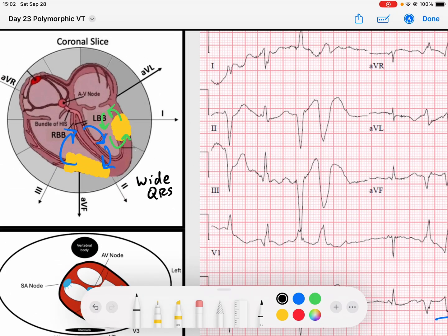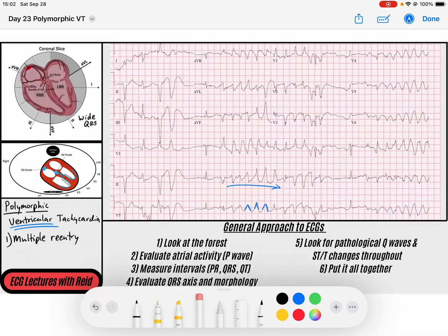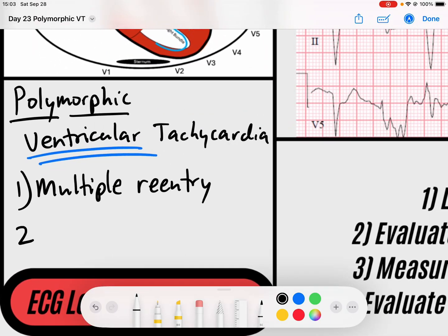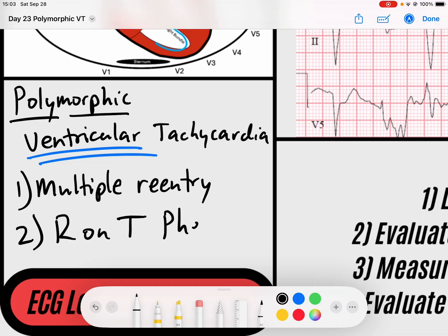The other way that we can get this is something very interesting — a phenomenon that we have here in the EKG. It's another form of polymorphic VTAC called torsades, and torsades can occur with a certain phenomenon called the R on T phenomenon. The R on T phenomenon occurs when you have a QRS complex that occurs on the T wave of the previous beat.